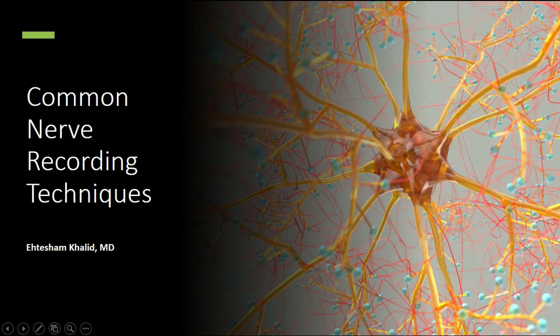Now, talking about nerve conduction study, most of the nerves that we test are distal. So again, there are some limitations to that, but we can also test proximal nerves as well, which is not as common of a routine. But just remember, what I always used to tell whenever I present nerve conduction EMG is that it is the extension of your examination.